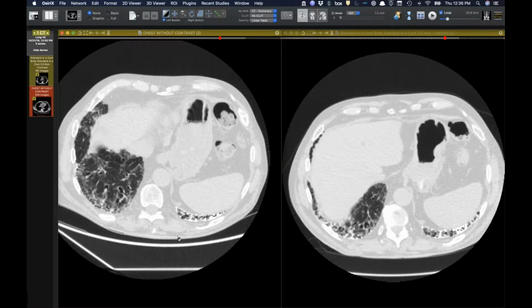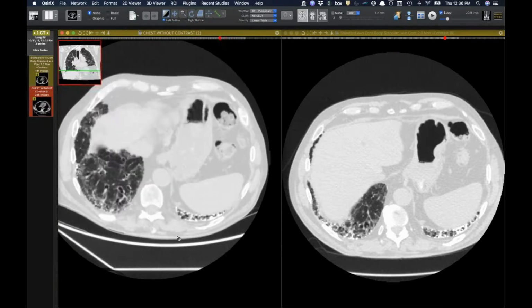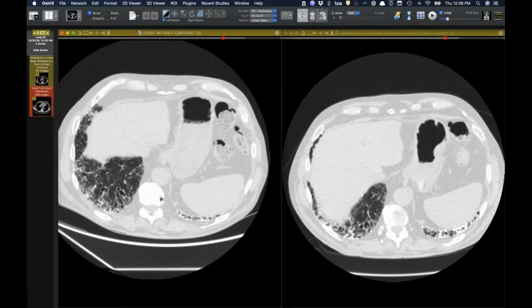If I see this finding, even more mild than this, just a few areas that are clearly dendriform pulmonary ossification, it definitely makes me lean towards UIP, or I'll come down stronger on UIP. That had been my experience, and they very nicely showed that in a nice RadPath paper. Okay, yeah, I don't think it was from here.